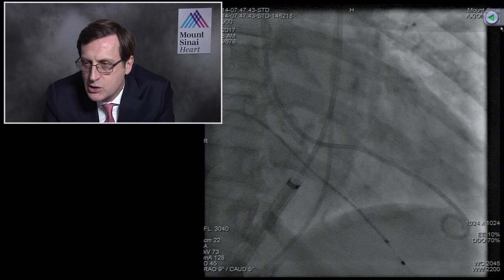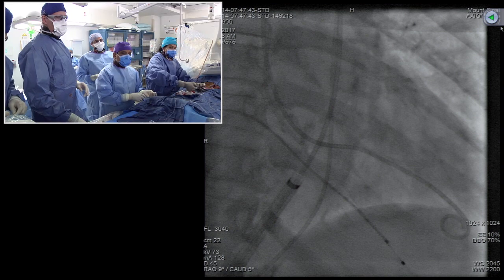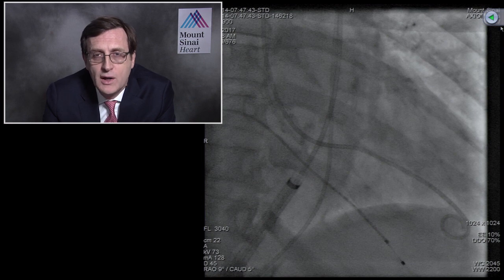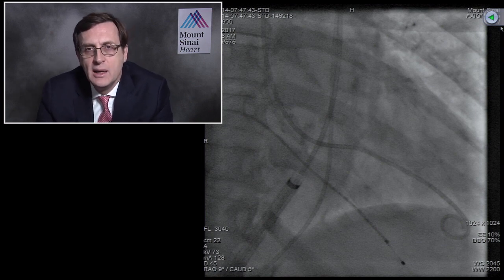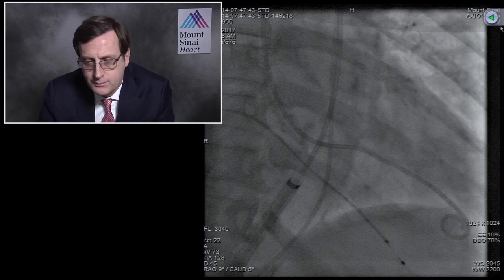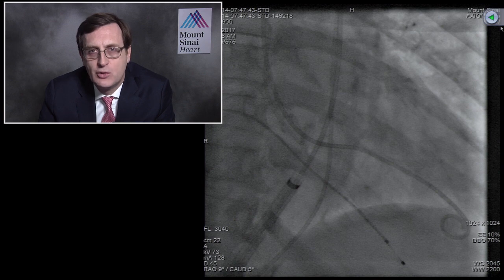The embolic protection devices only deal with the ostia and the proximal part of the carotid arteries and the innominate, and they take into account the tortuosity as well as the calcification, and exclude those cases, particularly when you have both tortuosity and calcification at the takeoff. No need to even try that.